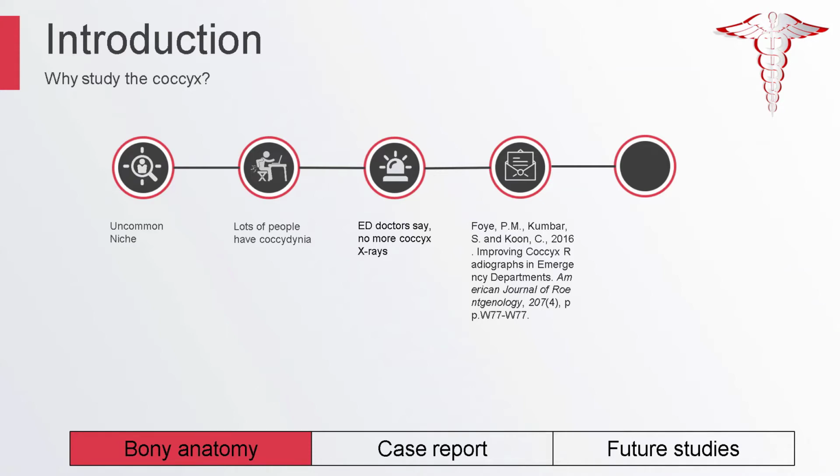Particularly the fact that sitting x-rays, dynamic x-rays, are not accepted mainstream. They're not part of the CPT, the current procedural terminology for radiology. It's difficult to obtain sitting x-rays. So clinicians still only do standard x-rays. So going with that, I'm wondering, what exactly does a standard x-ray show us?